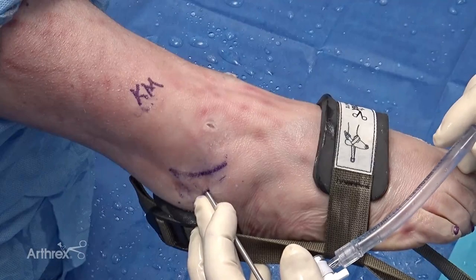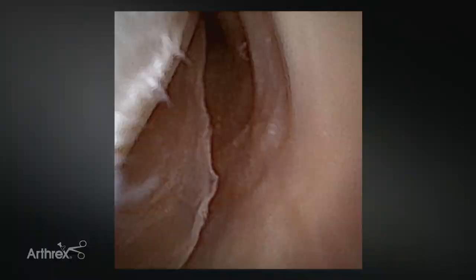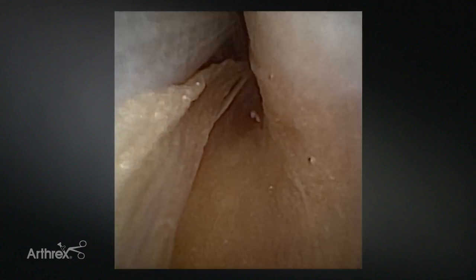Another advantage of nano needle is how small it is. We can easily pop into the peroneal sheath and do a nice diagnostic examination of the peroneals. Nano needle being so small allows me to travel up the sheath and actually get a dynamic exam where we can flex and extend the foot and watch the peroneal tendons glide in their native position, without disrupting the retinaculum.